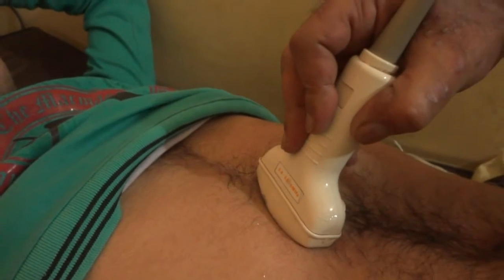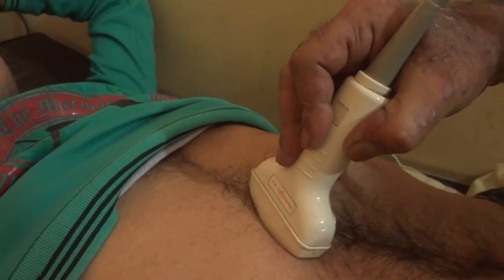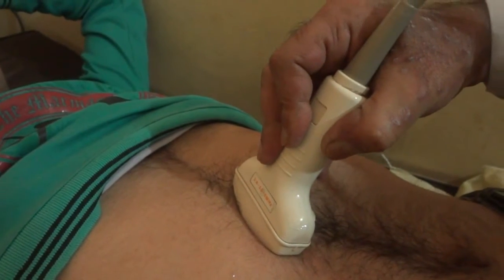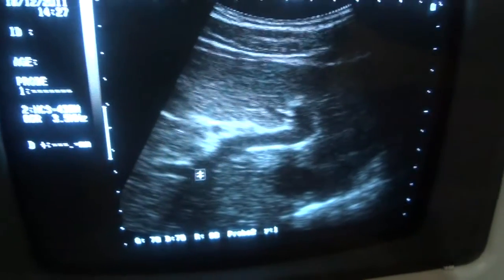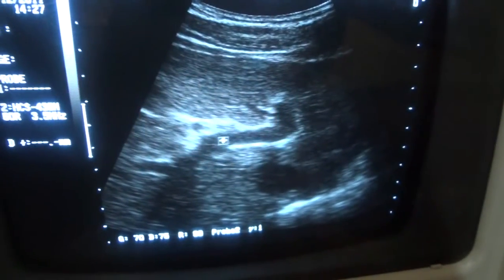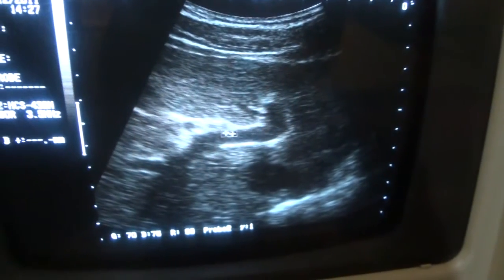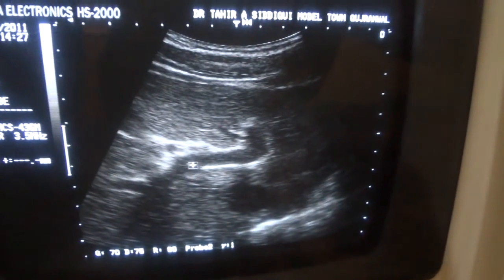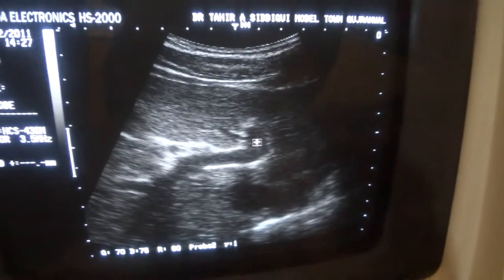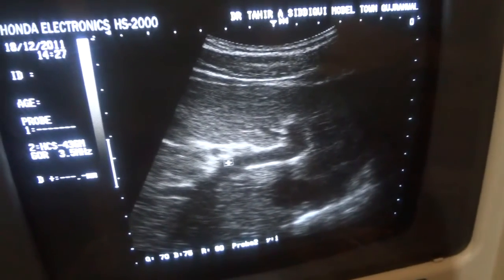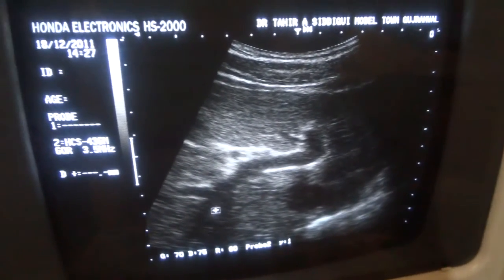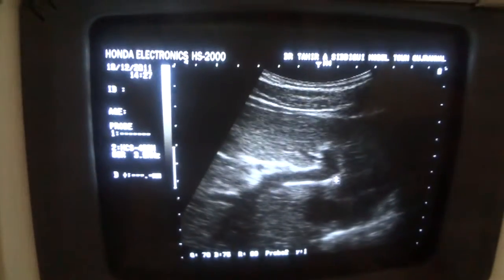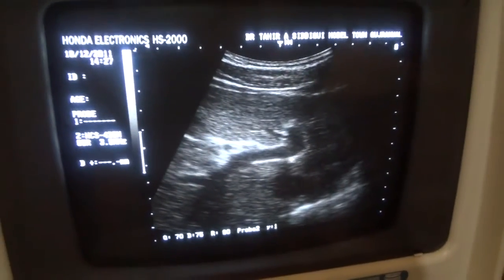If I tilt the probe a little bit in this direction, I can see the right portal vein and the left portal vein. This is the left portal vein, this is the right portal vein, this is the ascending portion of the left portal vein, right portal vein, left portal vein, and the ascending portion of the right portal vein.